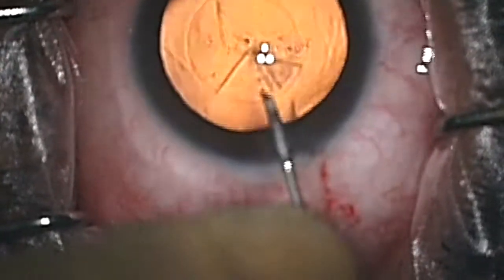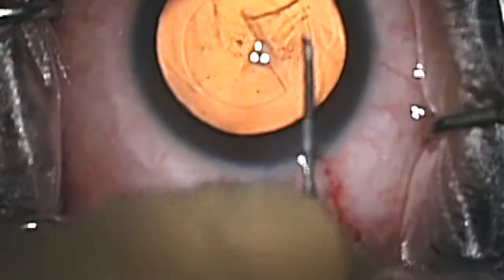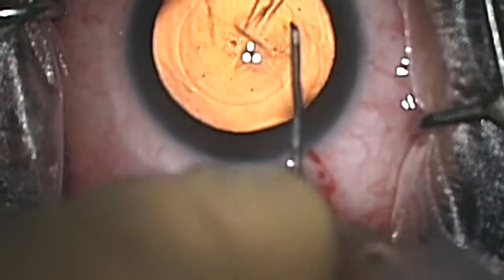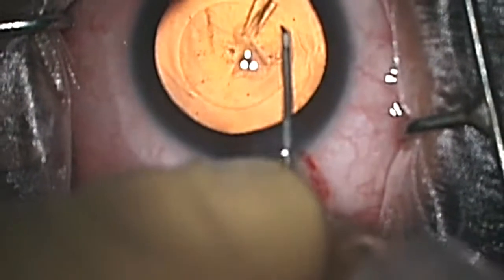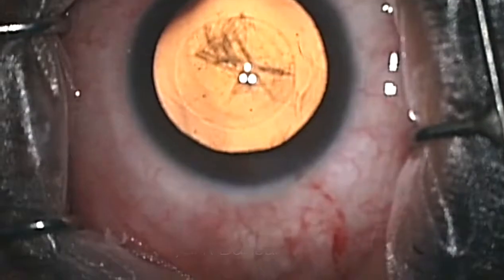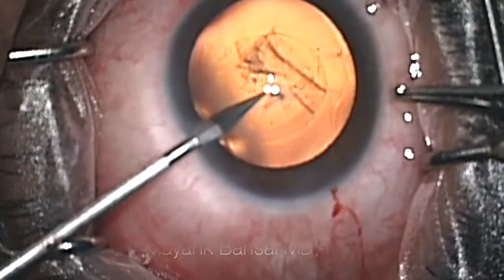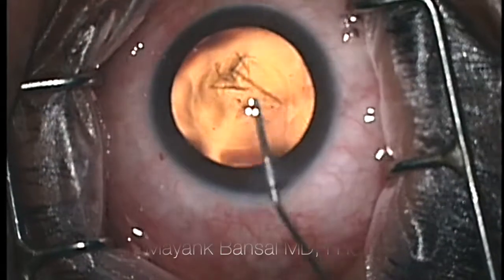Now, this capsular bag — think of it like a bag which is holding all of the cataractous lens. We want to get a nice circular opening so that we're able to, at the end of the surgery, implant the artificial lens inside it. Also, when it's a nice circular opening, we're able to do the phacoemulsification without any complications.